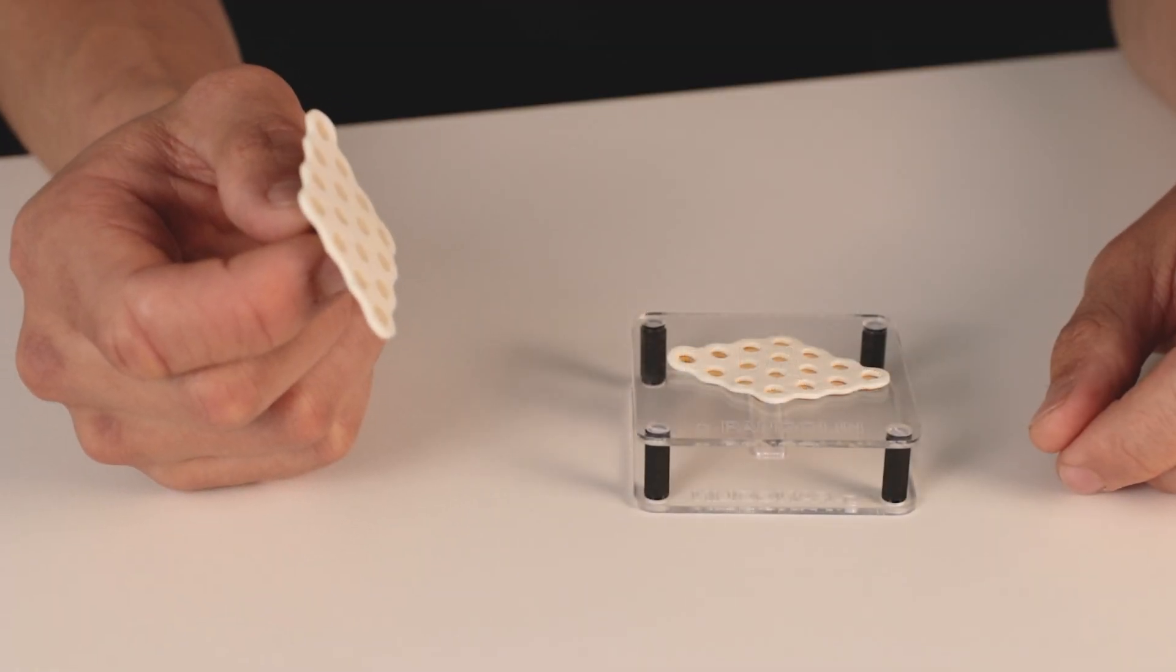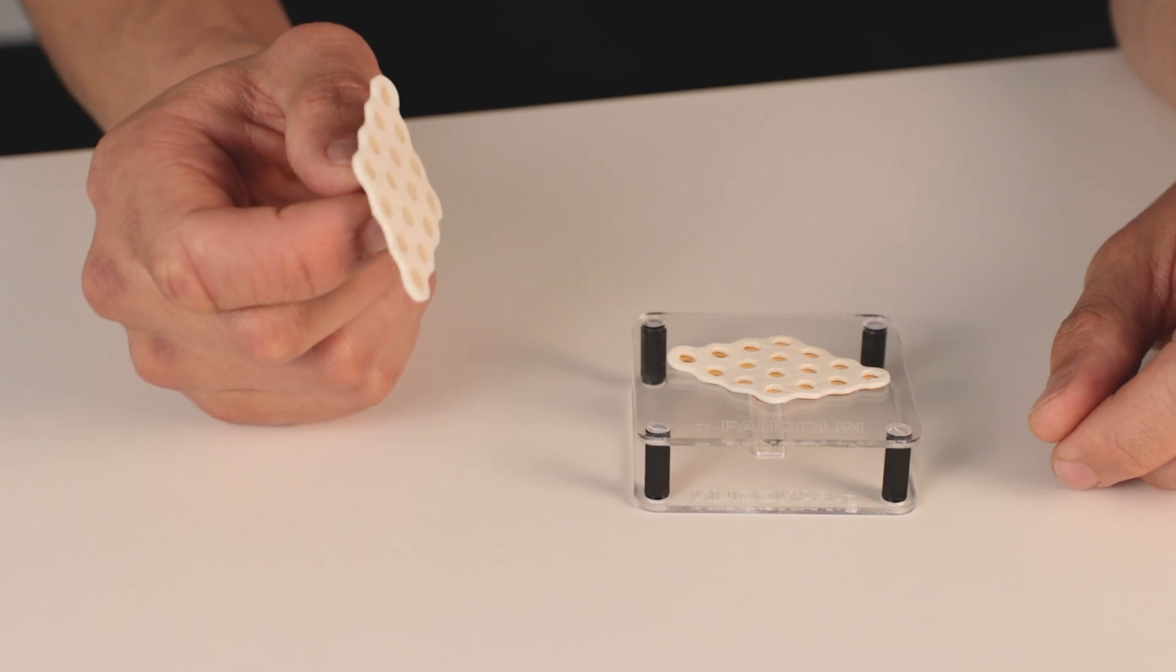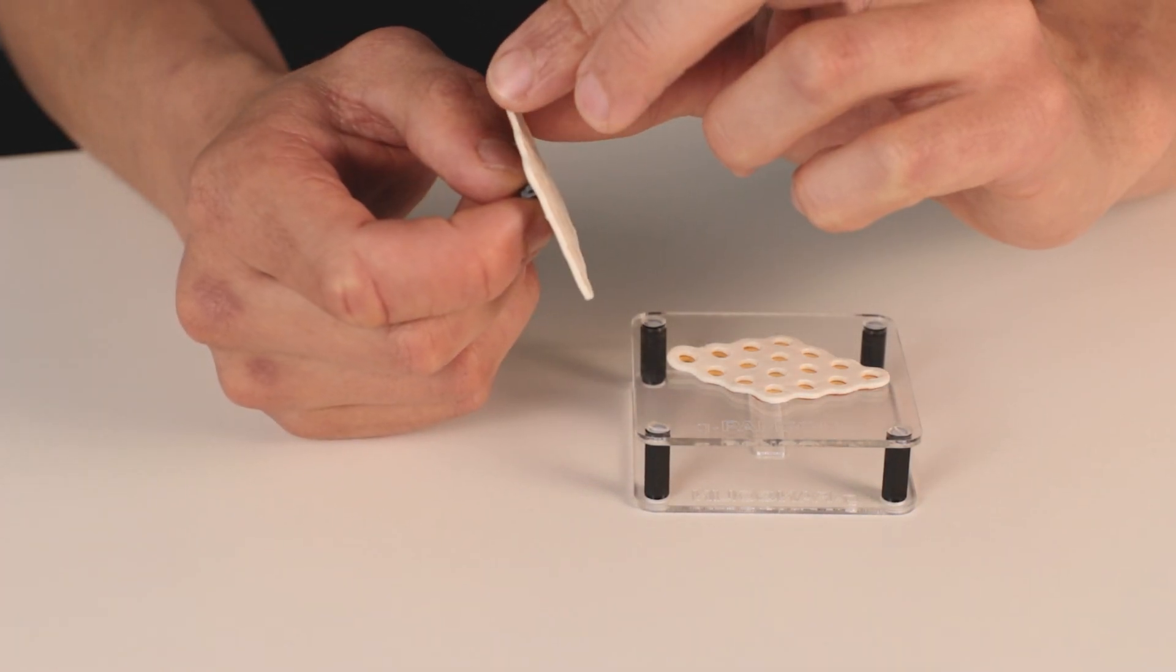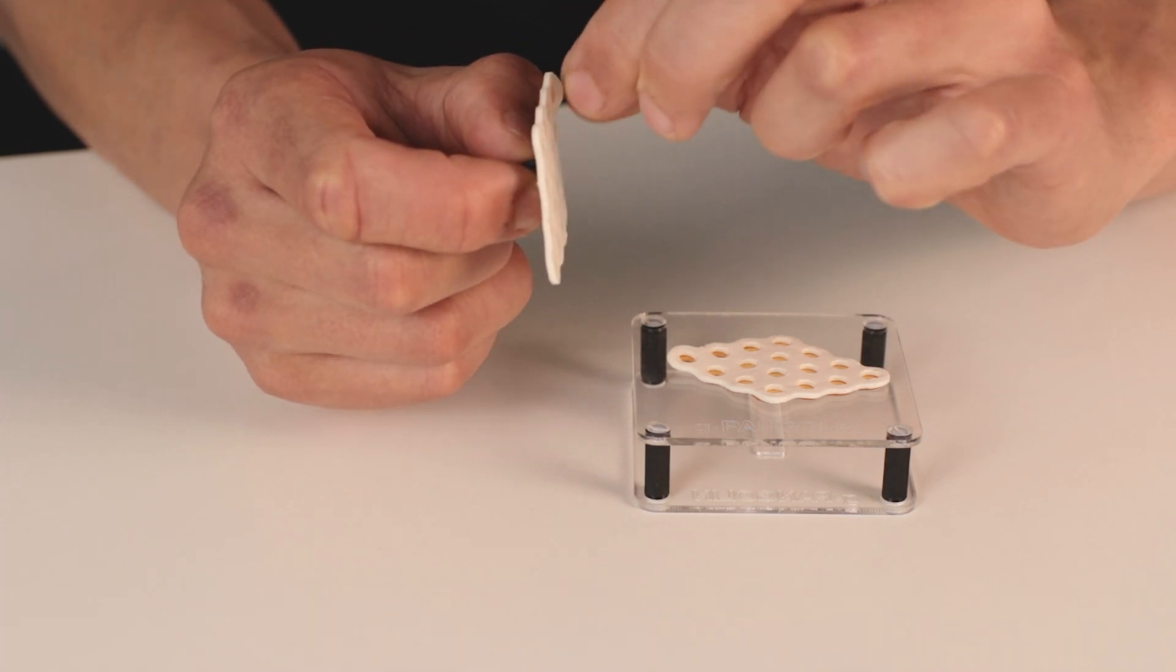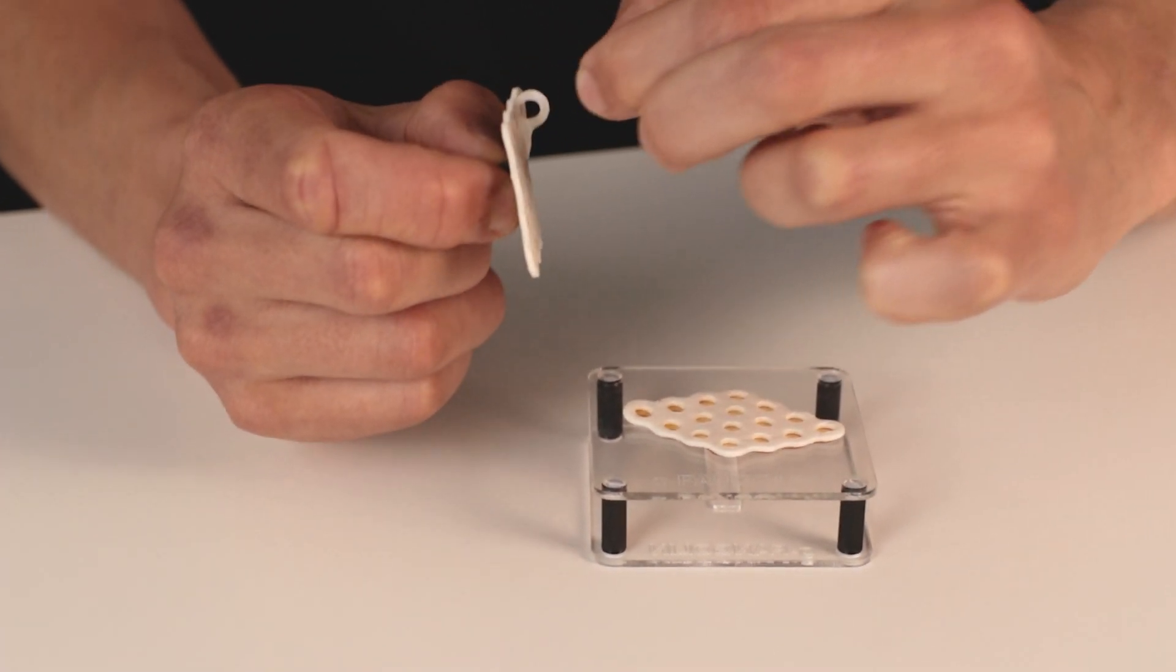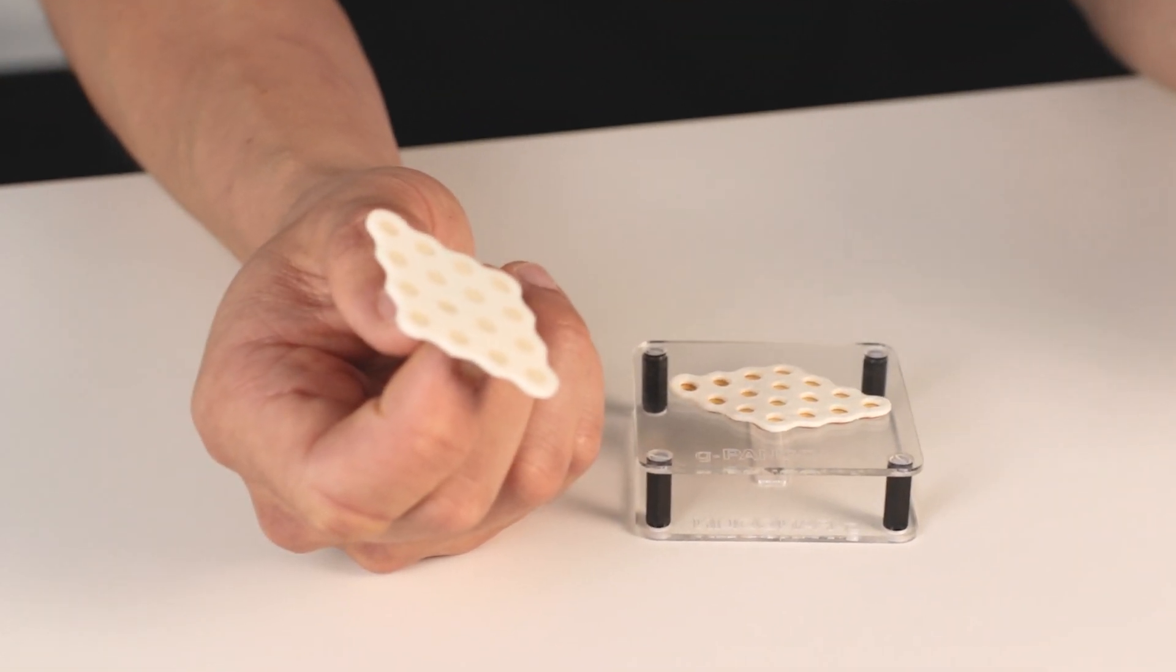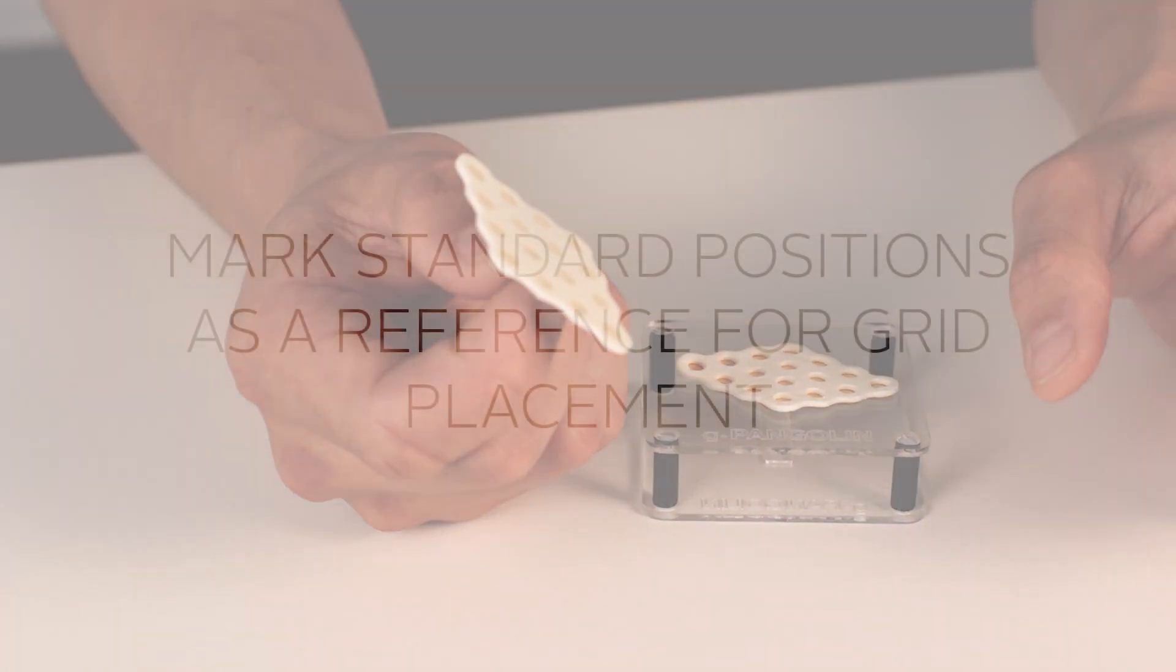As a last step before applying the grids to the scalp you have to remove the liner from the adhesive. Try to gently pick the liner from one corner and remove without touching the filled electrode dots. After removing the liner the grid is ready to be placed on the skin.